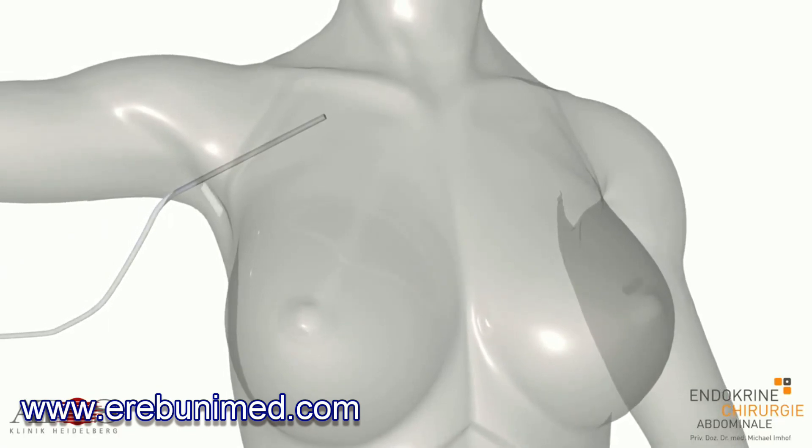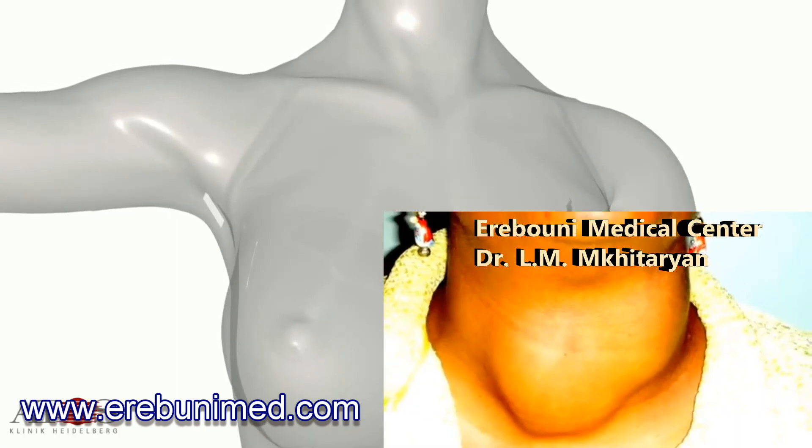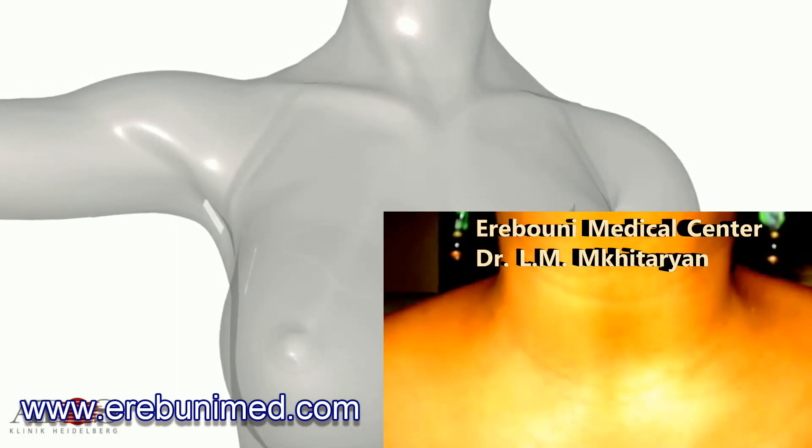The breast and armpit incisions are closed with steric strip adhesive tape. After only a few weeks, the scars are as good as invisible.